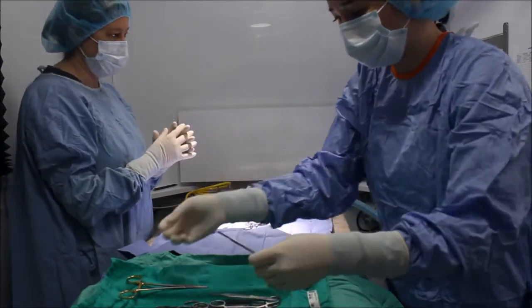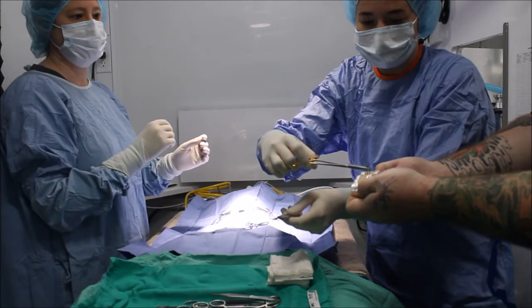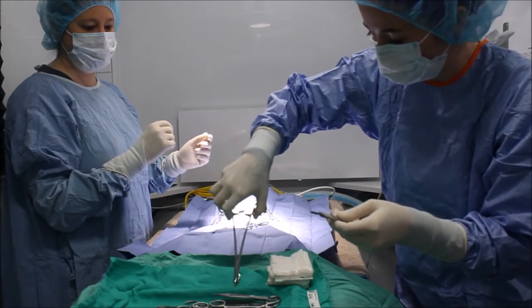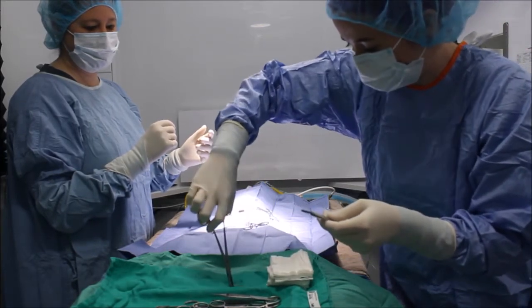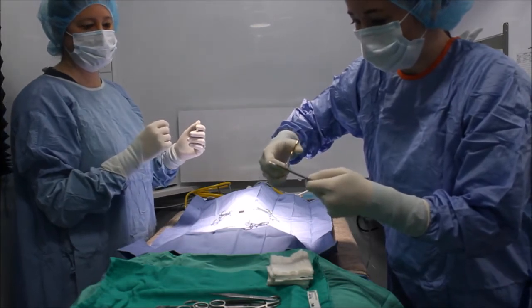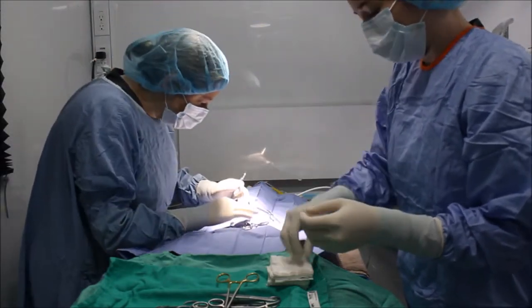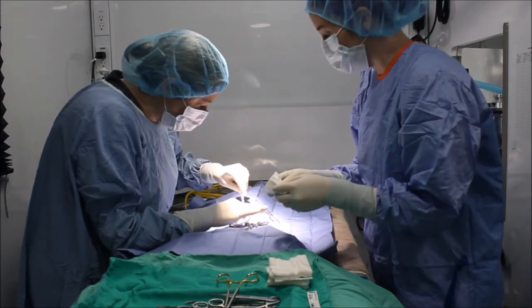I'm going to get my scalpel blade and my assistant is going to grab that for me. I'll take my needle holders and grab that, then firmly snap it in place. As I hand the scalpel, I want to hand it with the blade away from me and place the handle in my doctor's hand. As she's cutting, I'm going to get sterile gauze to maintain hemostasis and a clear visual field and blot blood as needed.